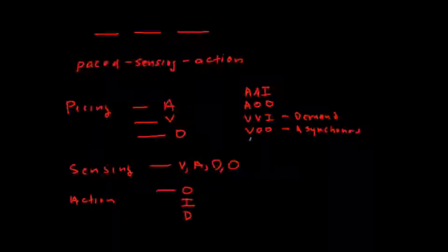And finally, to round out our list, we have the dual chamber analogs of these. DDD means you're sensing both atrium, meaning you have actually atrial and ventricular wires. You're sensing both, and if there's an atrial impulse, it'll inhibit. And if there's a ventricular impulse at a certain interval and rate, that it will also inhibit. And then finally, there's DOO.